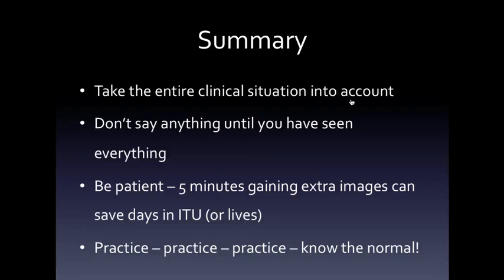I think in my own experience, it's when you start off backing the wrong horse that you go down a road, and the further down the road you go with the clinical diagnosis, the more you then use other tests to justify the wrong diagnosis. I don't know if you ever find that, but you kind of go down a road. And I would say that the greatest addition to the intensive care unit is an echo machine that resides in the intensive care unit, so that we all speak the same language, so that we work collaboratively between cardiology and intensive care medicine.